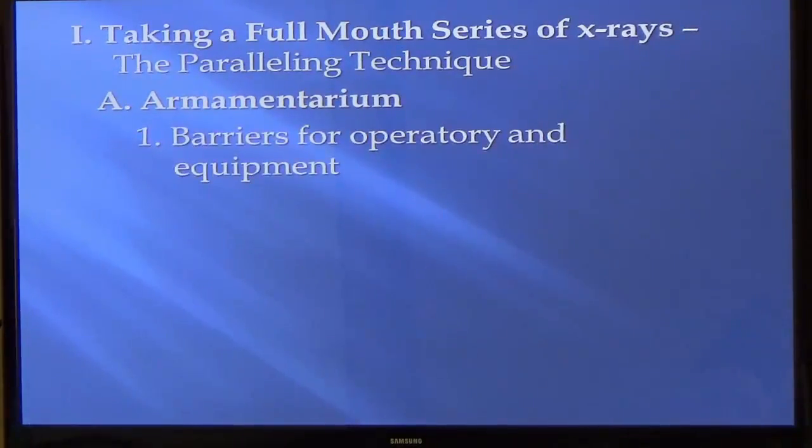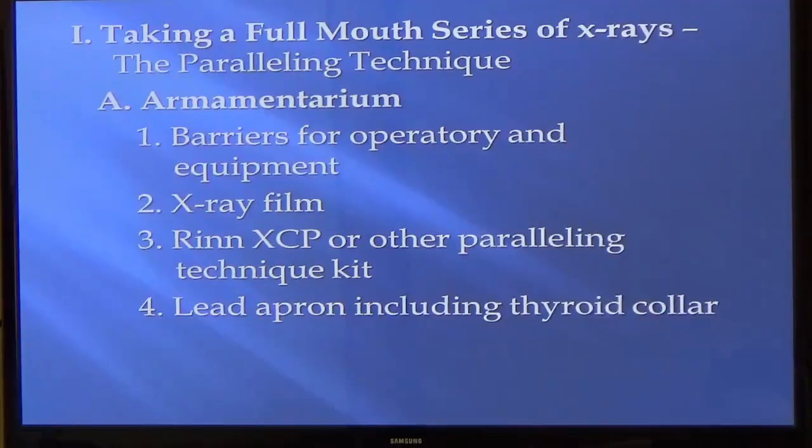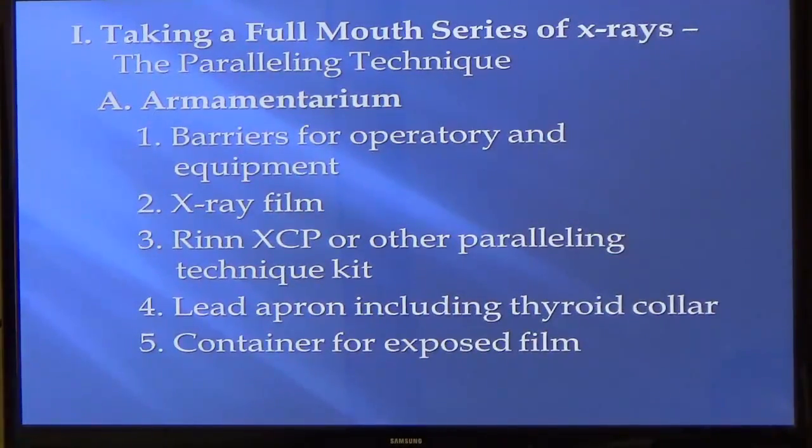What you need for armamentarium — this is what's going to be set up. You're going to need the barriers on your operatory, make sure everything's ready. You need the film, whatever holder you're using — these are XCP holders, or you can use the little alligator one. You need the lead apron and the thyroid collar for your patient. A container for exposed film, or some people just use a cup. Some lay out their template and flip over the ones already taken so they don't reuse them. You'll come up with your own technique. And a paper towel, because when it comes out of the mouth it's usually all slobbery — make sure you dry them.